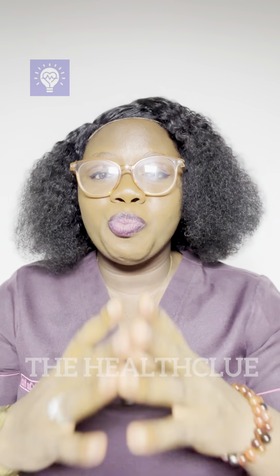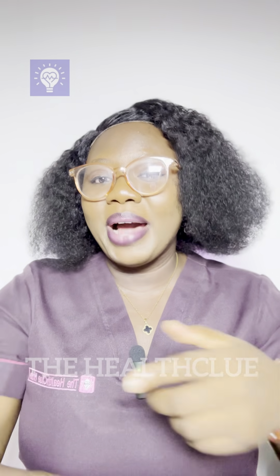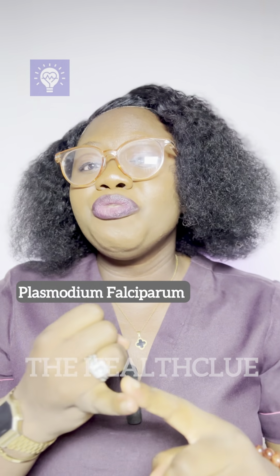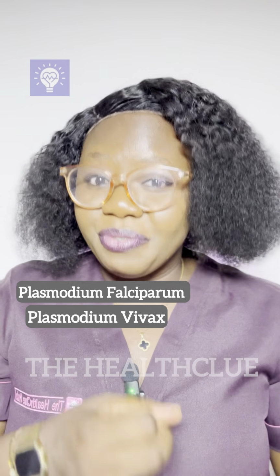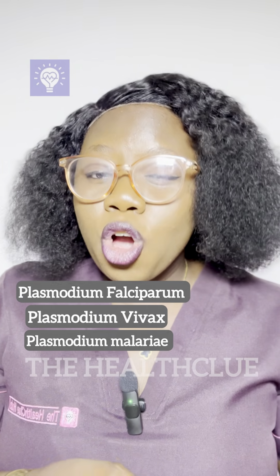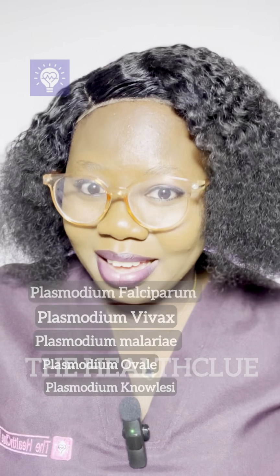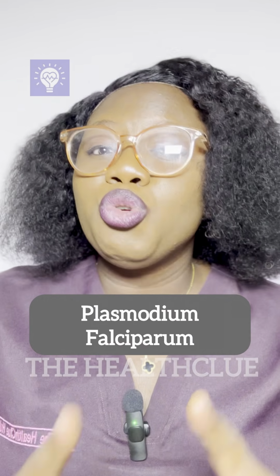And RDT is programmed to react to only one kind of Plasmodium species. When it comes to malaria, it's a Plasmodium species that causes malaria. Like when the mosquito bites you, it drops a species that causes the malaria. So we have 5 types of Plasmodium species. We have Plasmodium falciparum, Plasmodium vivax, Plasmodium malariae, Plasmodium ovale, and Plasmodium knowlesi. And this RDT is just programmed to react to only one Plasmodium species, which is Plasmodium falciparum.